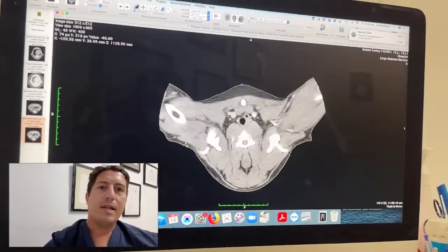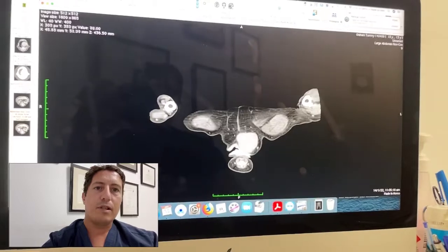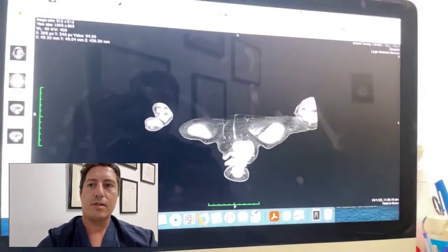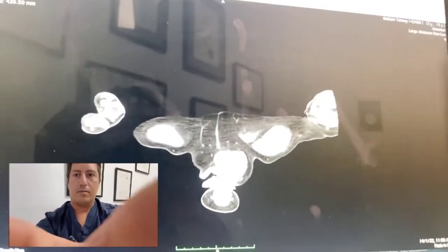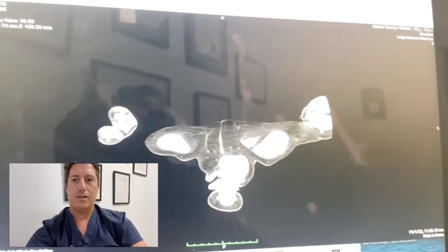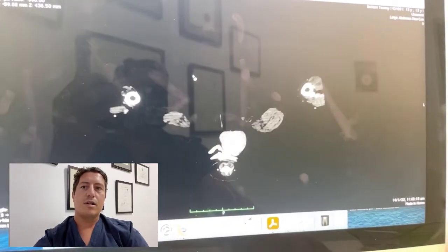So in this case, let's start back at the back. We've got a left-sided anal sac tumour this time. I'll just try and change the contrast on this, see if I can improve that for you, see if I can come closer and make that better. Bear with me, technology. It's hard to get that to look better. I'll just try and change the windowing here a little bit.